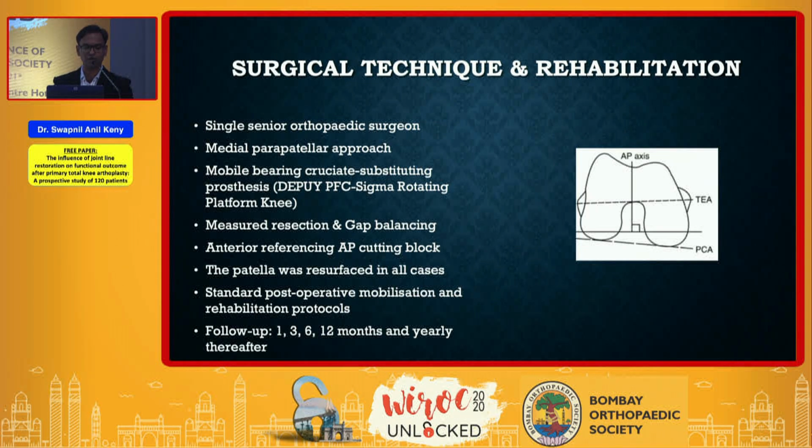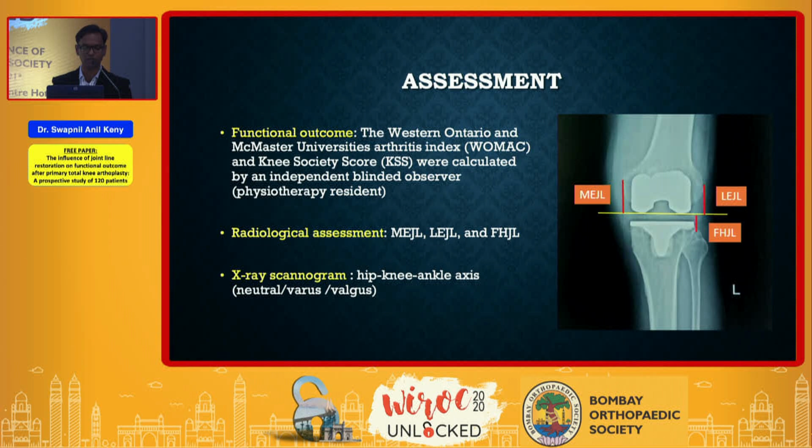All the patients were operated on by a single senior orthopedic surgeon using a medial parapatellar approach using PS implants, and the patella was resurfaced in all cases. Intraoperatively, we used the Whiteside line and the transepicondylar axis, which was encouraged. Standard postoperative mobilization and rehab protocols were ensured, and the patients were followed up at 1, 3, 6, and 12 months.